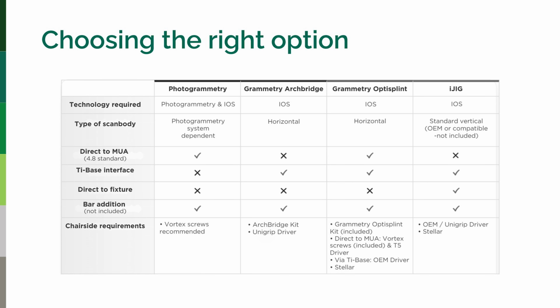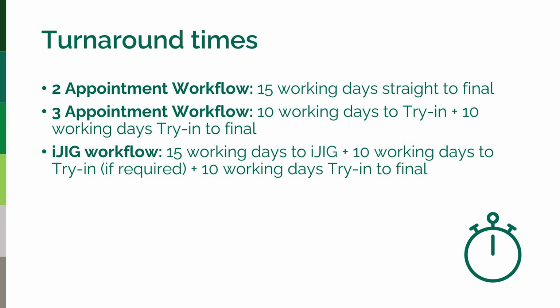And this is just going to go through, again, the technology required, the type of scan body, whether it can go direct, what type of interface you're going to use, whether you want to include a bar, all of these things, and some of the equipment that's required. And our turnaround times to appointment workflow, which is really where a lot of these cases can sit.